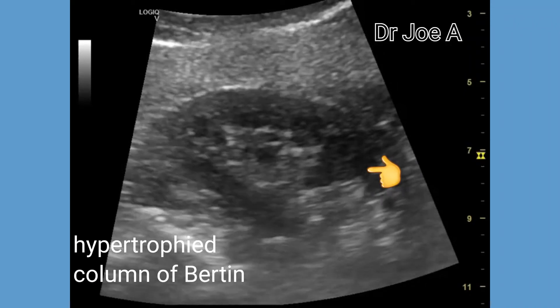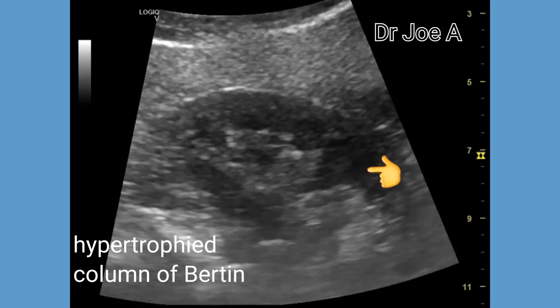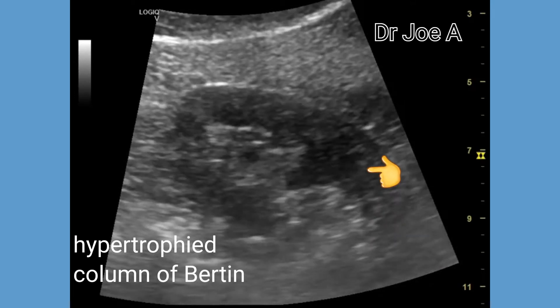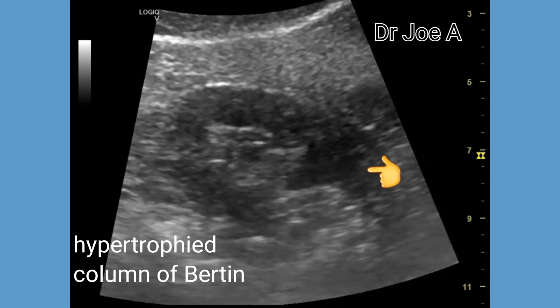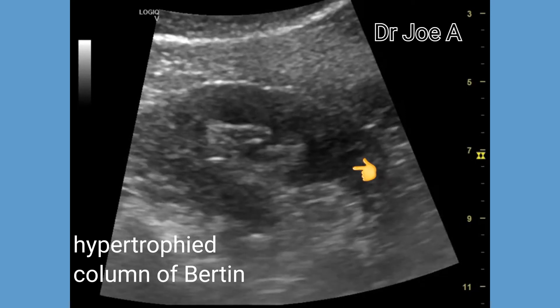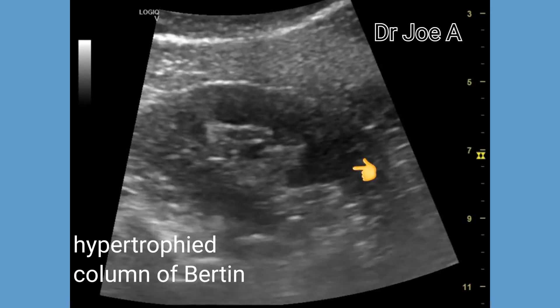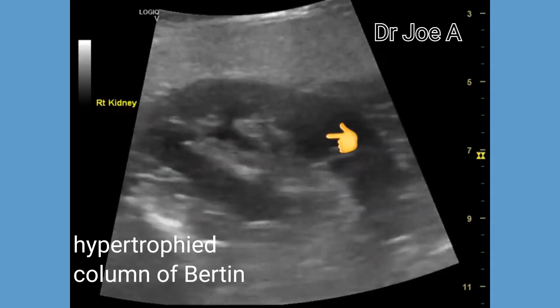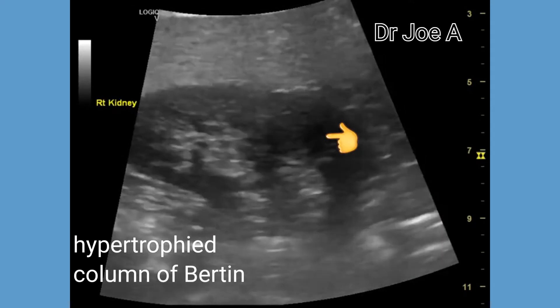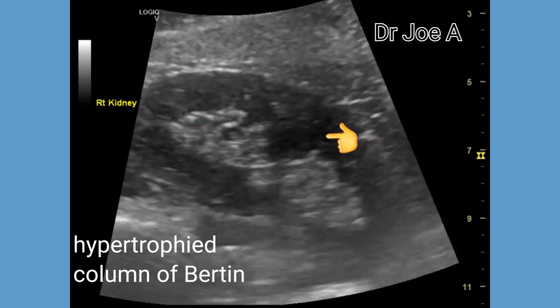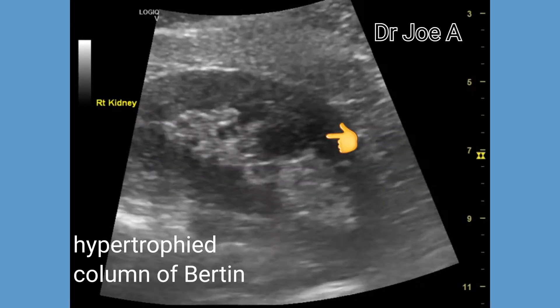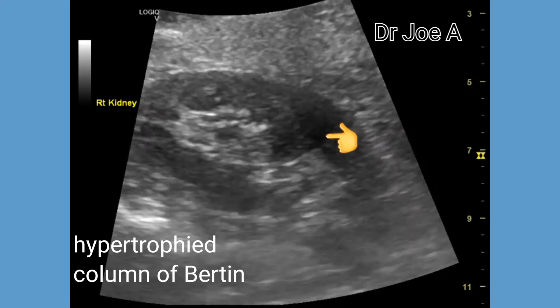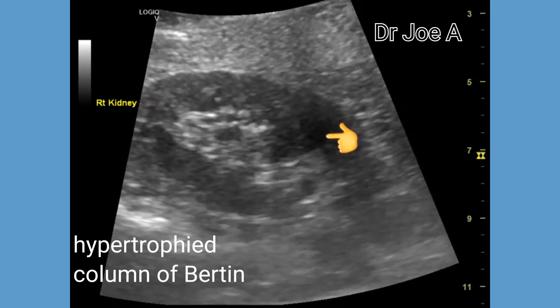This is a case of a normal anatomical variant called hypertrophied column of Bertin. A column of Bertin is normally seen as an extension of renal cortical tissue into the medulla between the pyramids. In this case, however, the renal column of Bertin is hypertrophied or prominent, and hence it is called a hypertrophied column of Bertin, or a prominent column of Bertin.